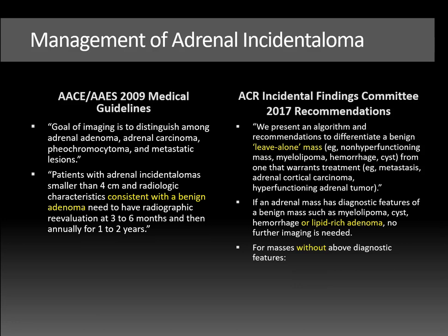Radiology recommendations go on to state that if you have a mass that does not have diagnostic features, meaning it's not characterized as an adenoma or other benign mass, if it measures 1 to 2 centimeters, you could consider a follow-up adrenal CT or MRI in 12 months to document stability. But they don't mandate that follow-up is required since it's statistically still likely a benign nodule. However, if the nodule measures more than 2 centimeters and less than 4 centimeters, you should consider a more prompt follow-up imaging study to characterize that.